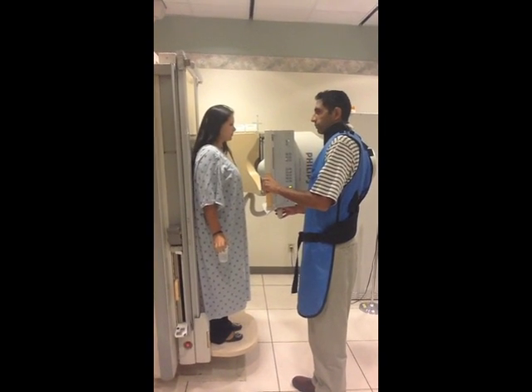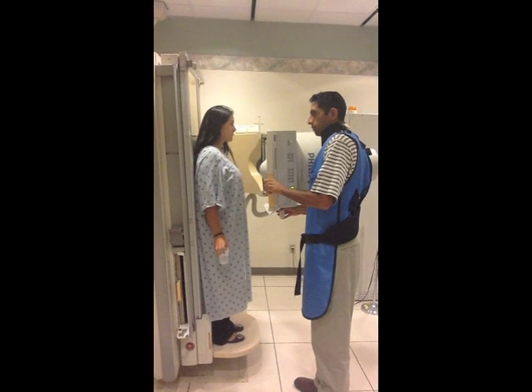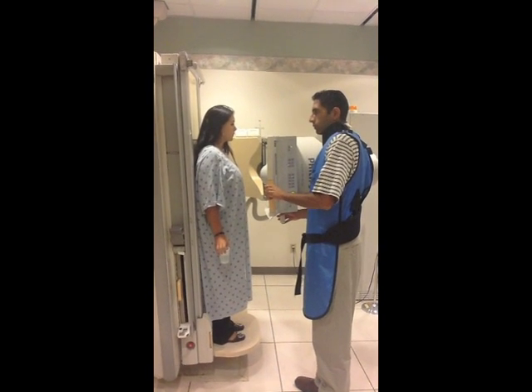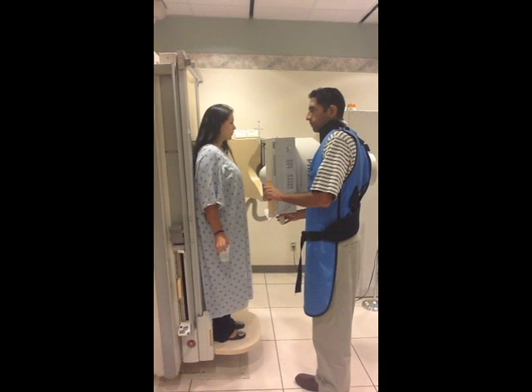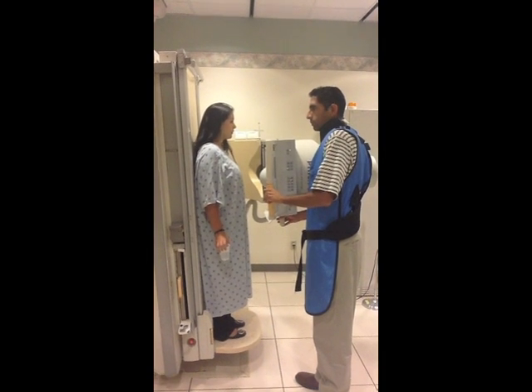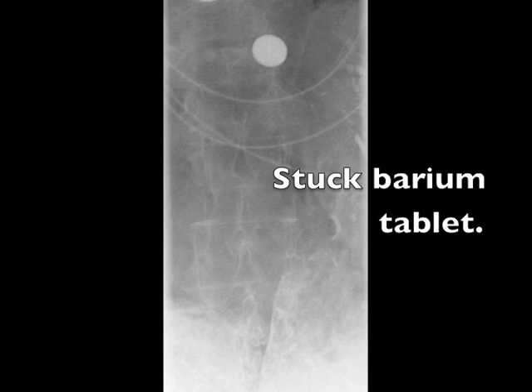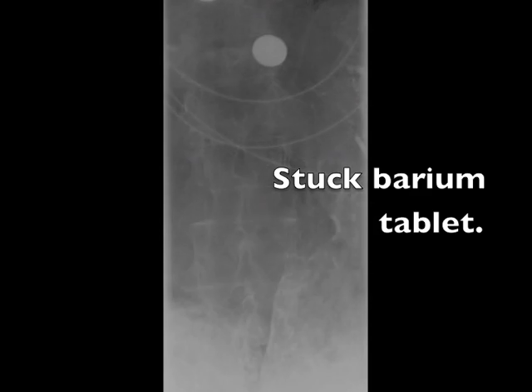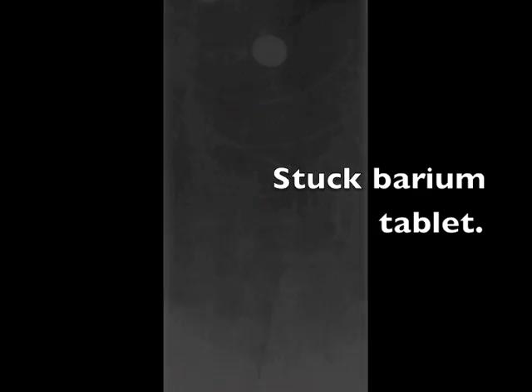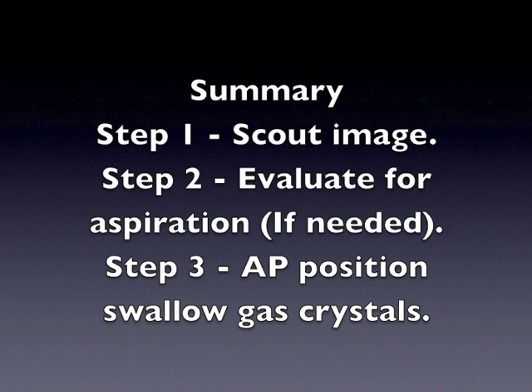No image capturing is required. If the tablet has not passed into the stomach, have the patient take multiple dry swallows or sips of water to assist with its passage. This is what a barium tablet looks like under fluoroscopy and when stuck at the gastroesophageal junction.